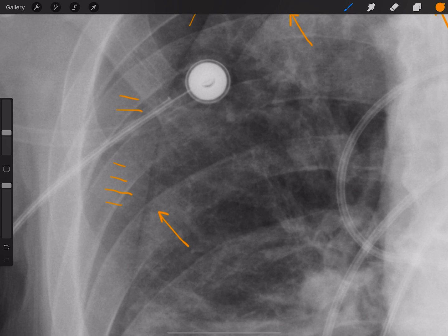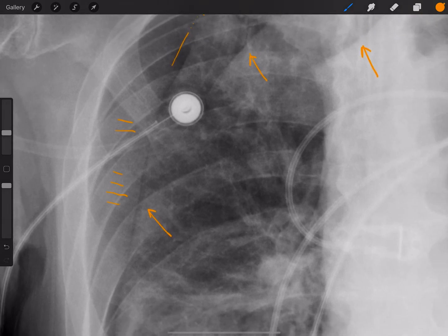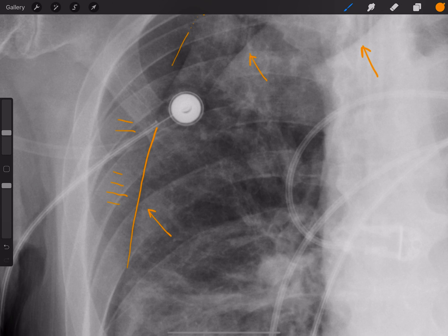The fourth reason is that a pneumothorax is going to be demarcated by a very thin radio-opaque line that represents the visceral pleura. In this case, we don't have a radio-opaque line — instead, we have a radiolucent line. What that represents is air trapped in between two folds of skin.